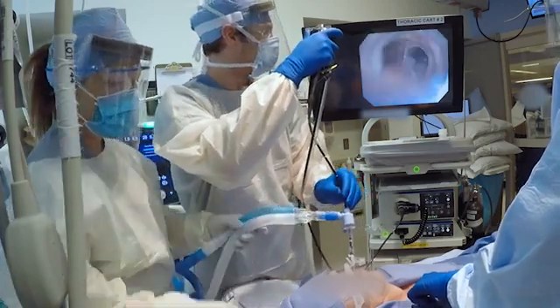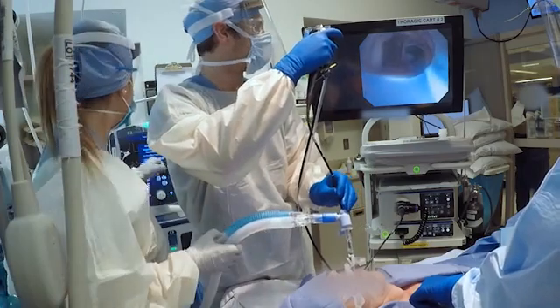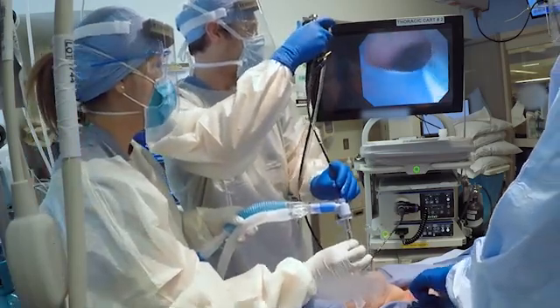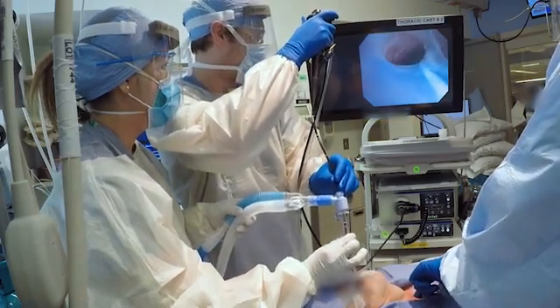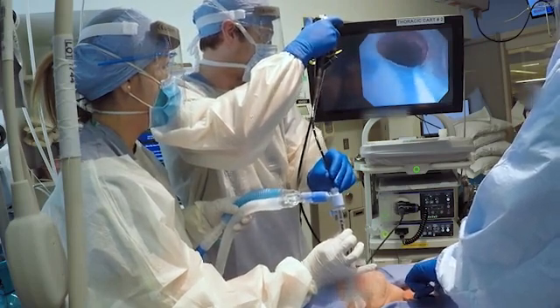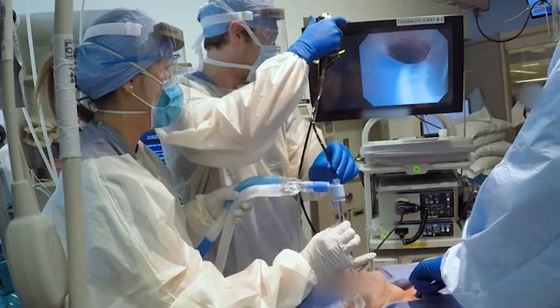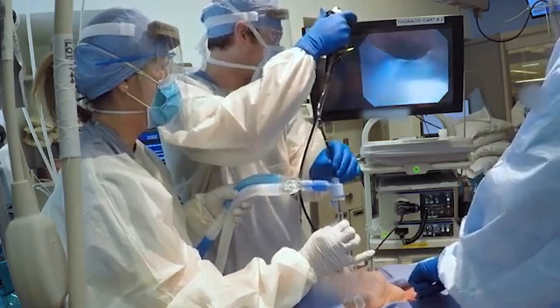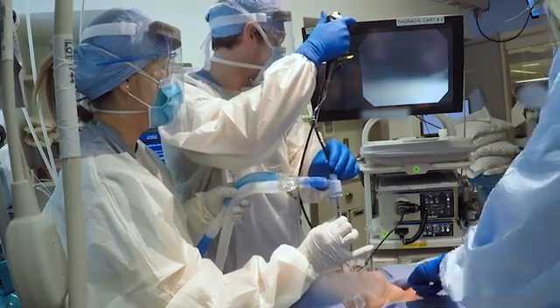The respiratory therapist and the bronchoscopist together then slowly withdraw the oral endotracheal tube and bronchoscope simultaneously until the subglottic landmarks are visible. Palpation of the anterior trachea by the surgeon can facilitate identification of these landmarks. The bronchoscope is kept within the oral endotracheal tube at all times to ensure control of the airway. Precise communication and coordinated movements between the respiratory therapist and bronchoscopist are crucial to prevent accidental extubation of the patient.